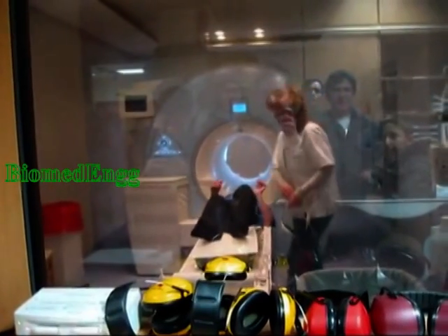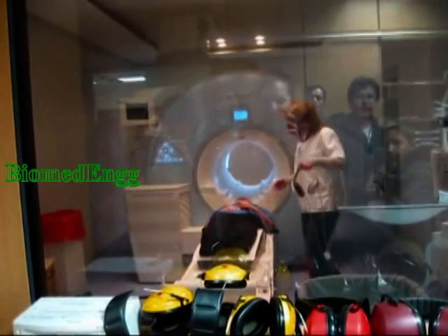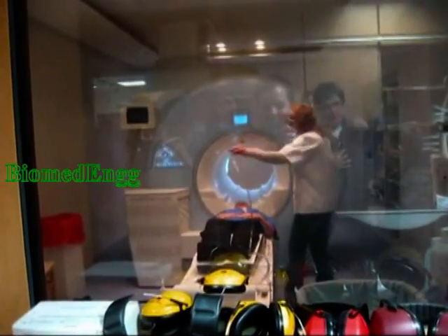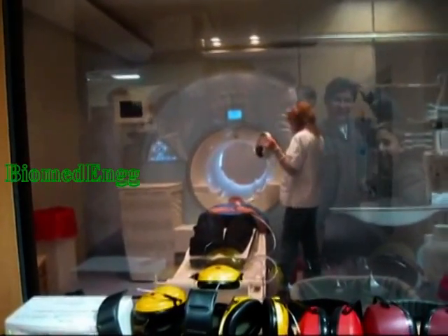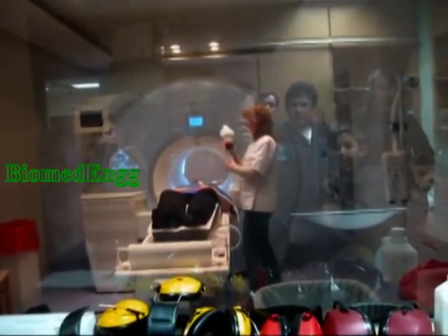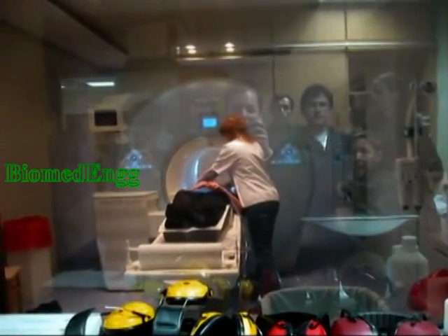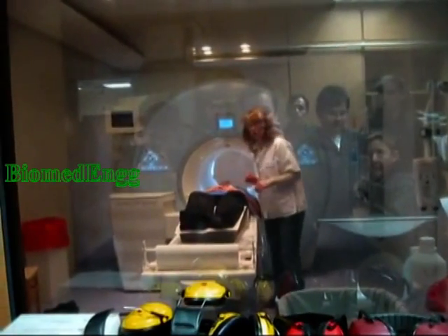This nurse has volunteered to do a full cervical spine series, which will take about 15 minutes. She is receiving a panic button that will stop the device and get her out in case she panics. She will also receive headphones, because the gradient forces that pull on the coils will cause really, really loud noises — sounds like a sledgehammer.